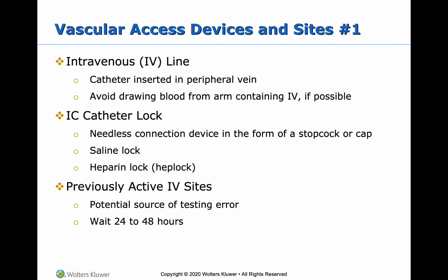Your best bet is to draw below a previously active IV site if you notice one, or if the patient's coherent and alert and able to tell you, oh yeah, they took that out 2 days ago, then you're okay to draw. You want to wait 24 to 48 hours. But there are some patients that aren't coherent enough to remember that it was in there 2 days ago. So in that situation, your best bet is to draw below a previously active IV site.